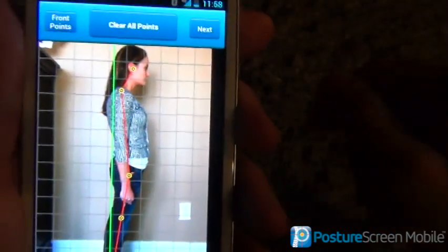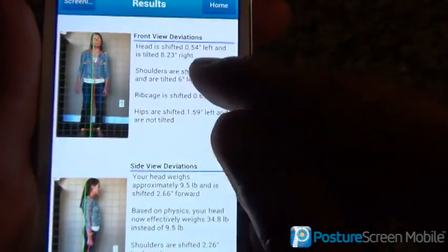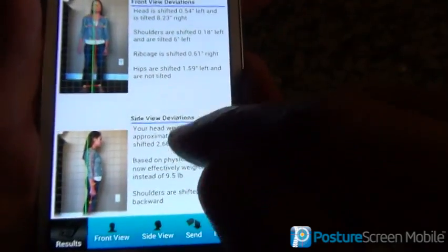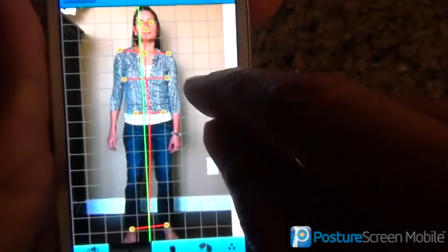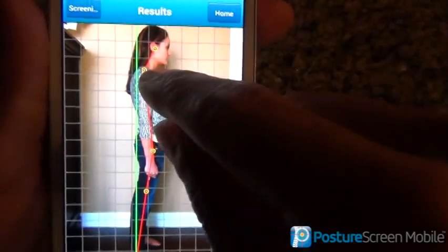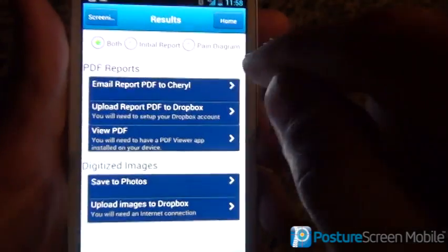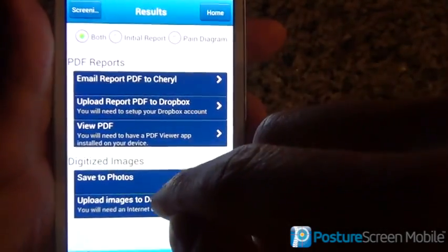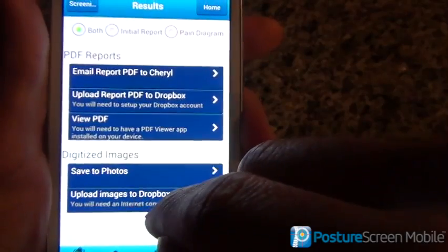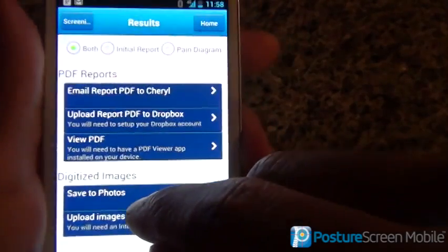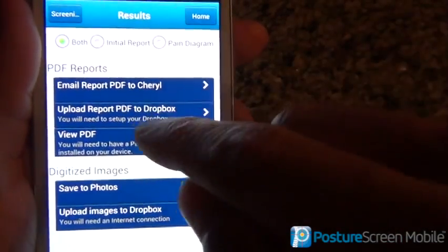Now let's hit next. Right here we have all the displacements forward from the front view as well as the side view. If we want to show the patient, we could show the patient — we can blow this up if we want to. And here is the send screens. If you already have Dropbox synced, you can upload just the images to Dropbox so you can drag and drop them into your Windows or Mac and keep them in the Dropbox folder for your other tablets.